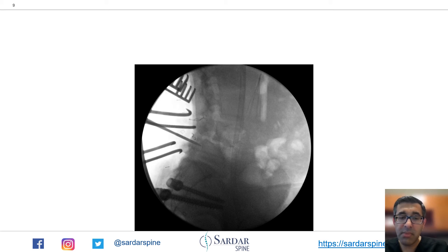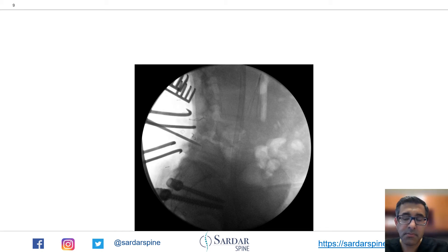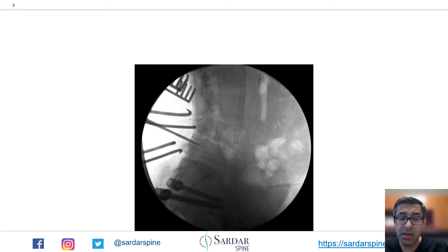I performed transforaminal interbody fusions from L4 to S1 to decompress the spine, to mobilize the spine, and also to get the lordosis.